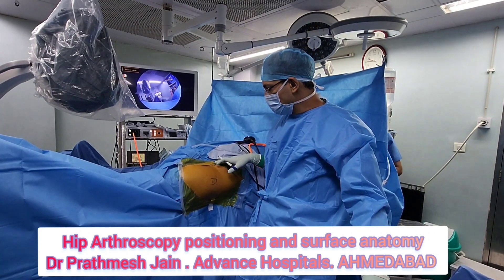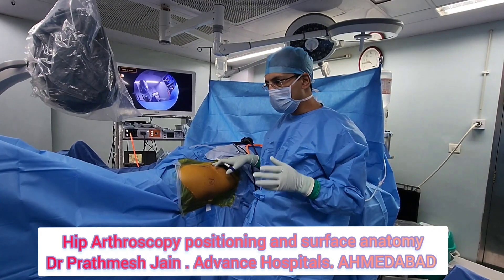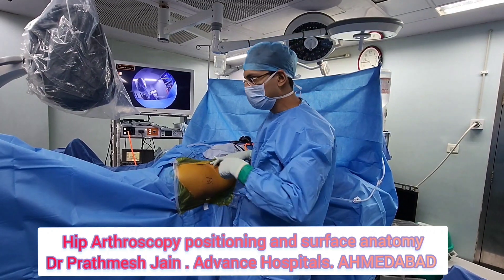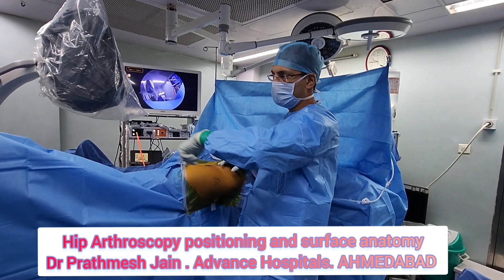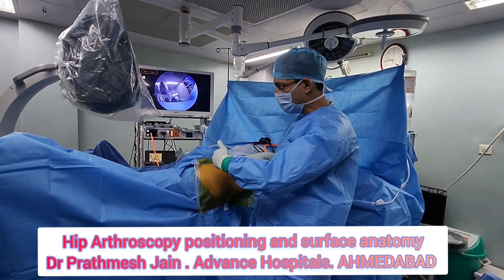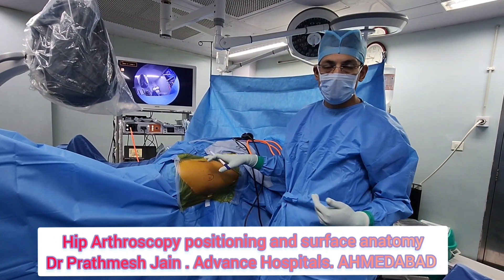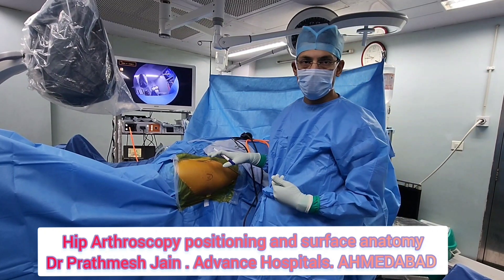The most important thing here is to give traction. The traction should be two-fold — you should be able to give a traction along the line of the limb and a traction laterally. Both these tractions are important in order to open the joint for the central compartment.